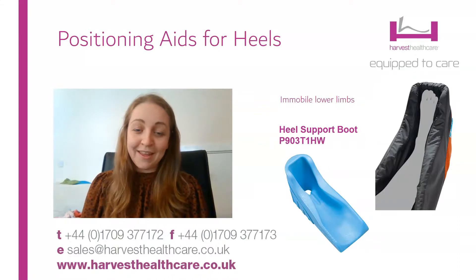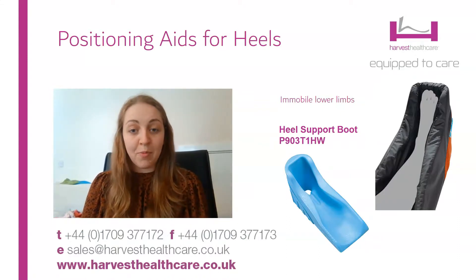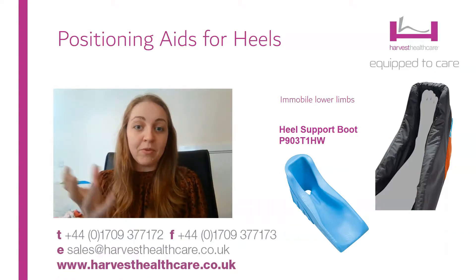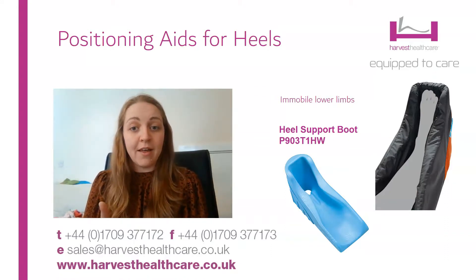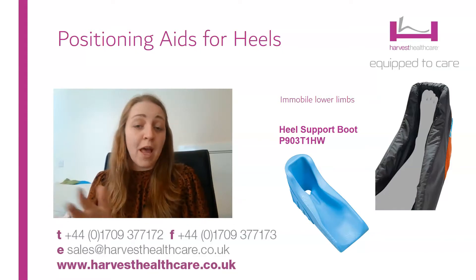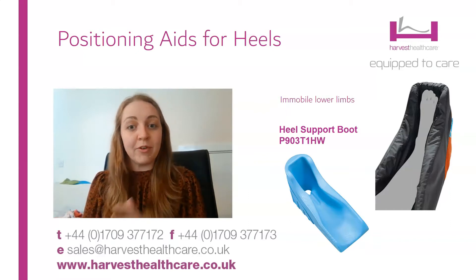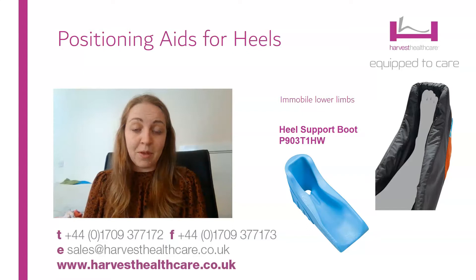Last but not least, we have the heel support boots. This is for patients or residents who are completely immobile. You can see from the picture there's a well at the back of the heel that provides complete pressure relief, and the boot comes all the way up the calf. That's for two reasons: one, it helps distribute pressure across all of those vulnerable areas in the lower limb, and two, it also helps prevent rotation of those legs.